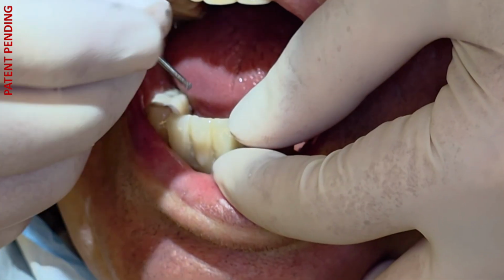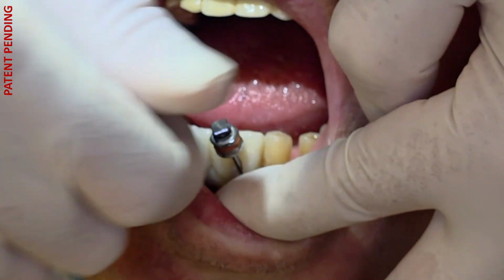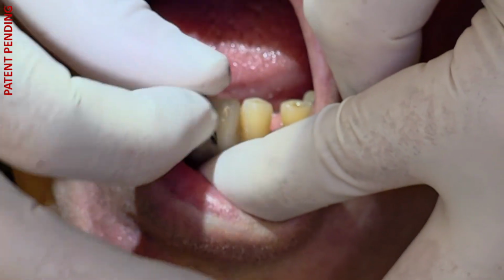Now I want to demonstrate the stability of the bridge. I intentionally left only one screw tightened to show that the bridge remains immobile. This result is achieved thanks to intraoral bonding of the sleeves. It provides maximum passivity of the restoration.